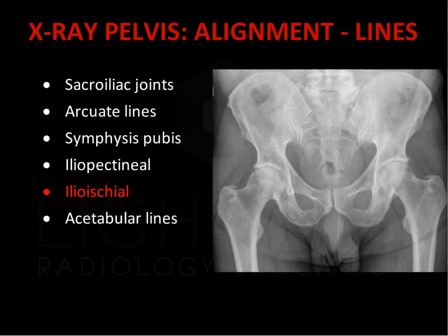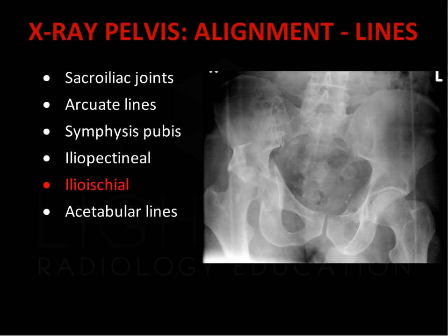The ilioischial line extends from the iliac bone to the medial wall of the acetabulum. As with the iliopectineal line, it should be a smooth curve with no focal cortical disruption. This case demonstrates a comminuted fracture of the right acetabulum with disruption of the iliopectineal line. The second injury to the main pelvic ring is a fracture of the left superior pubic rami with a corresponding fracture of the left inferior pubic rami related to disruption of the left obturator ring.